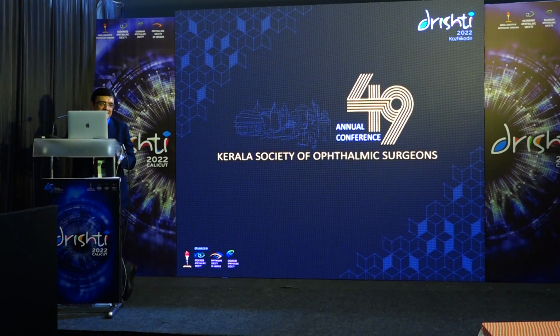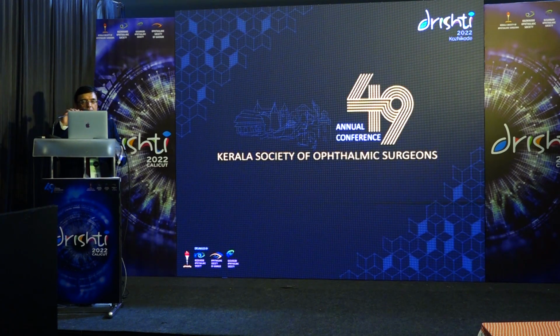So you said something is CSR, focal laser. So usually CSR beginning, we have a conservative treatment. So how long will you wait with the conservative treatment before you go for focal laser? So I do not treat a CSR patient at least for 6 weeks. It's a masterly inactivity, 6 to 8 weeks. We do an OCT, we see that the patient is overall improving, metamorphopsia is improved, patient is clinically improved on the OCT, then we wait.